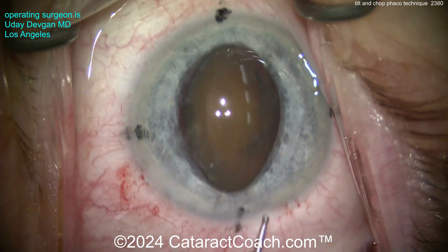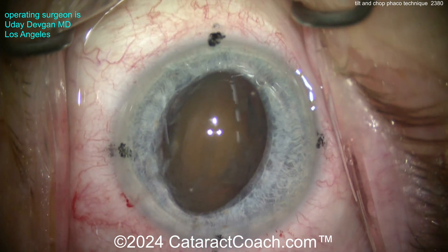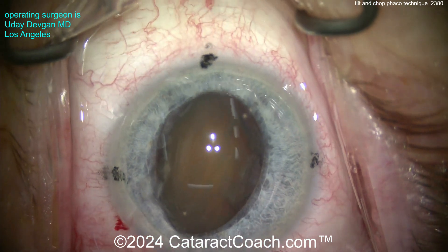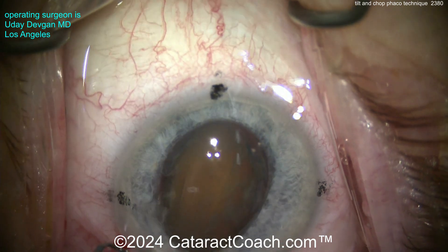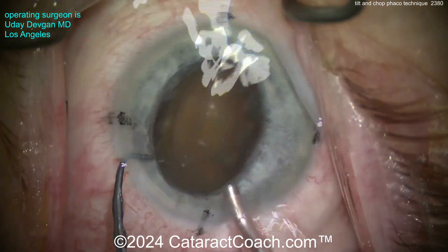The nucleus goes to the side port and we can just help get it up a little bit more. Now once it's in good position, let's recoat the central endothelium with a small aliquot of viscoelastic — some dispersive agent just to protect the cornea. Now going with the phaco probe on high vacuum, high flow: 400 millimeters of mercury and 40 cc's per minute of flow.